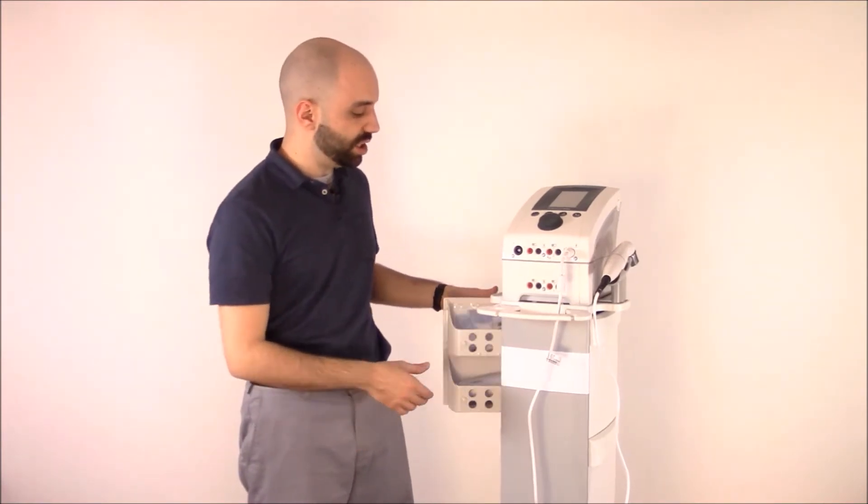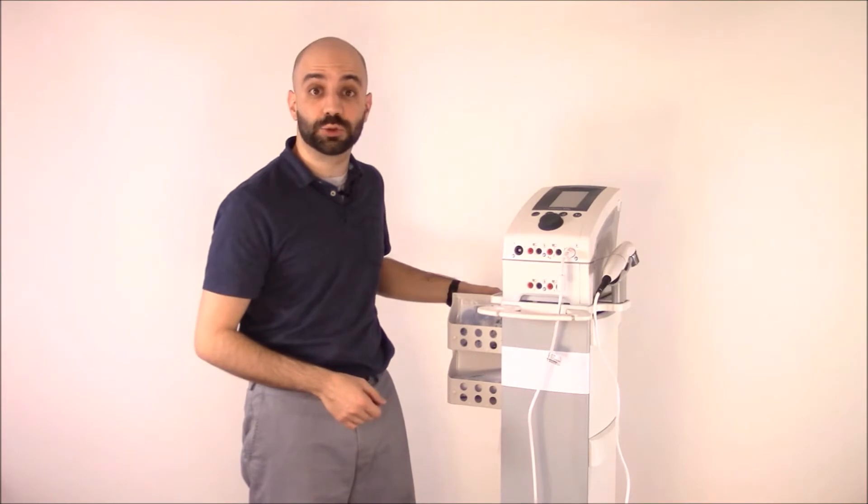The Intensity therapy cart comes with six drawers, three on each side, which are fully adjustable and capable of storing all of your supplies, such as lead wires, electrodes, and ultrasound gel.